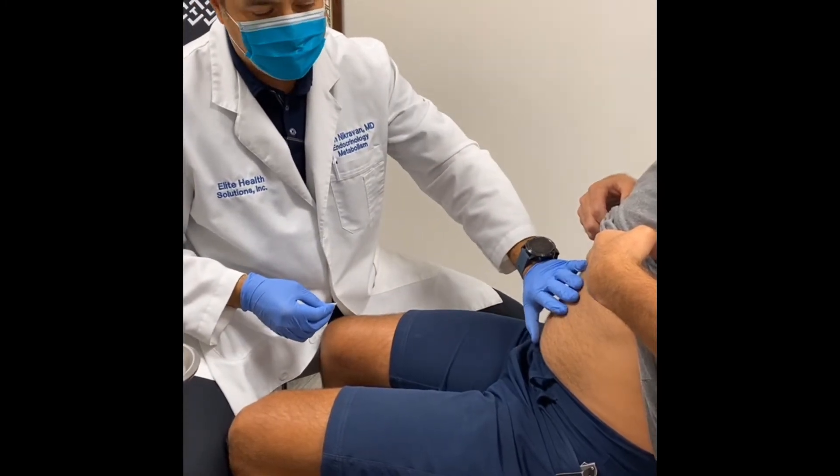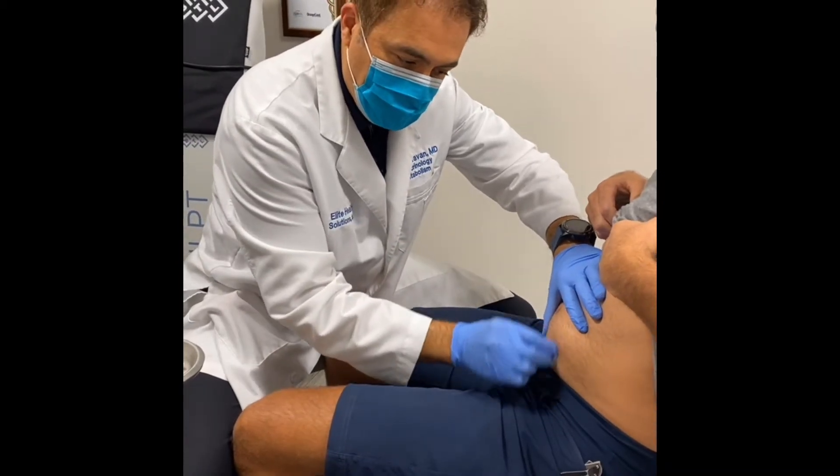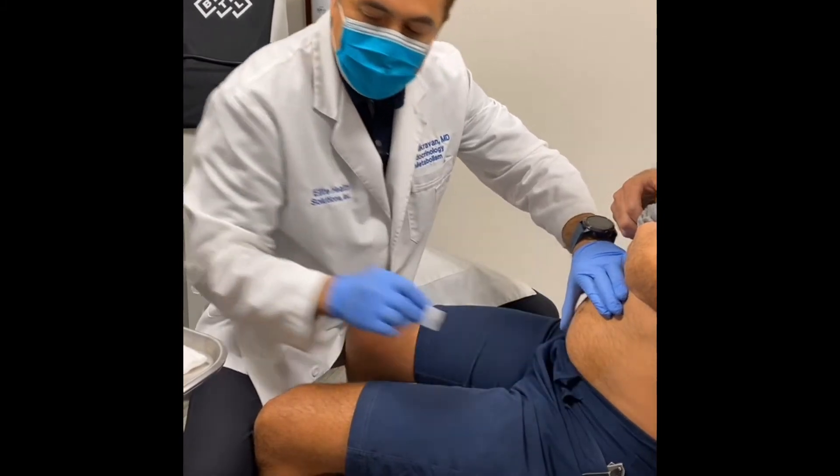So we're going to do a subcutaneous injection. What you do is you take alcohol gauze and in a circular fashion going inward to outward, you apply alcohol by cleaning the area.